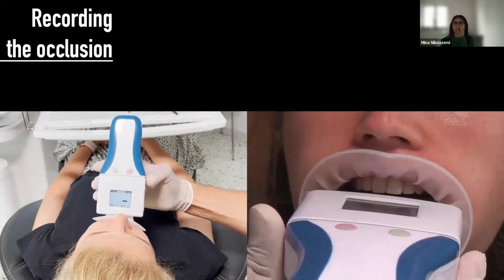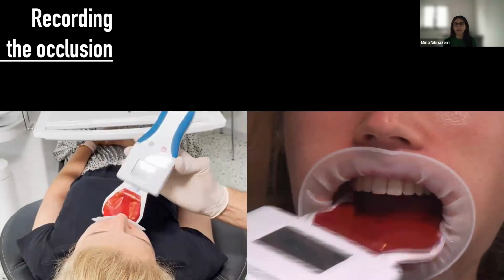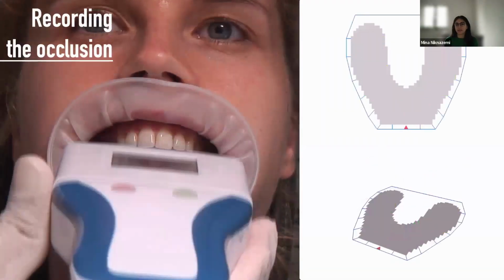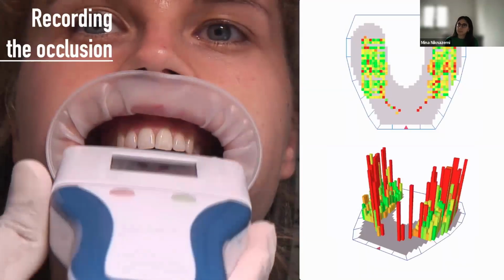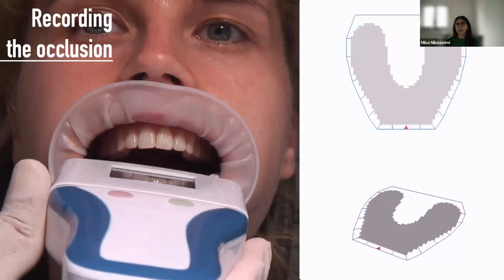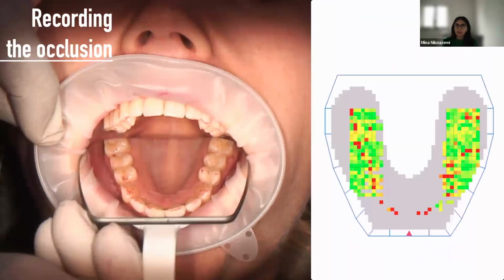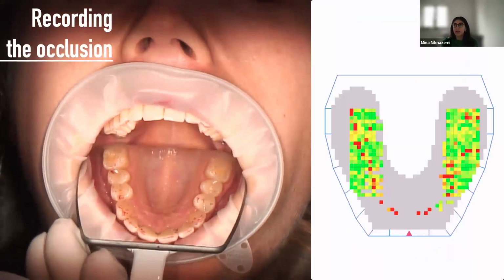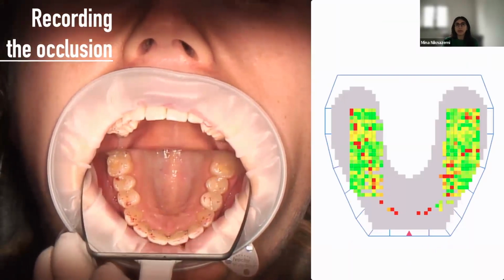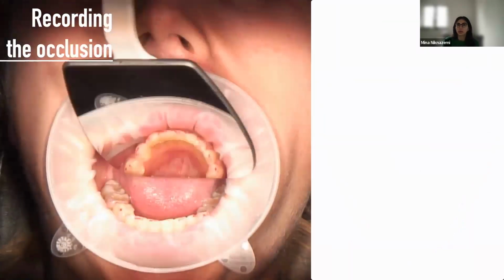And here we're conducting a couple of movements that you ideally practice with your patient beforehand, because having that much stuff in their mouth and around it is quite irritating. So if you practice it before, most of them will be able to comply. As mentioned previously, the markings are left on your patient's teeth. So any adjustments that you want to be doing can be done immediately after you have recorded your occlusion.